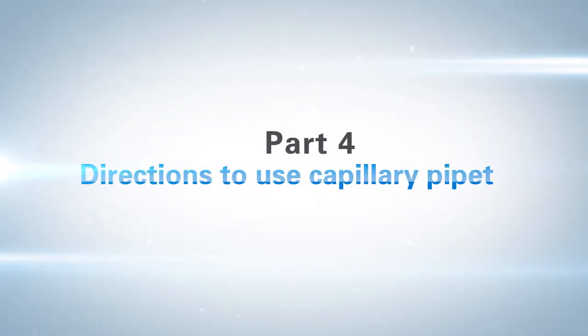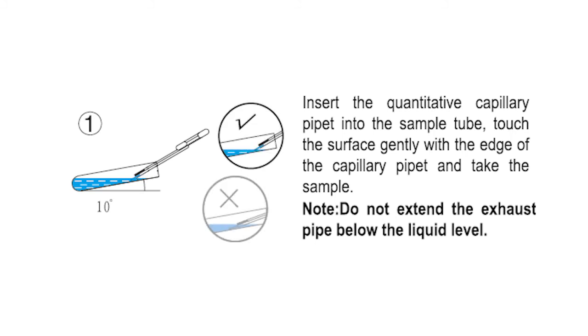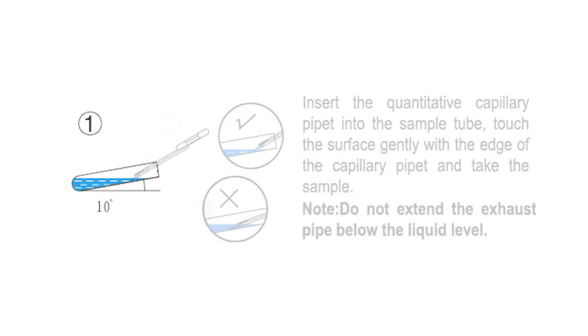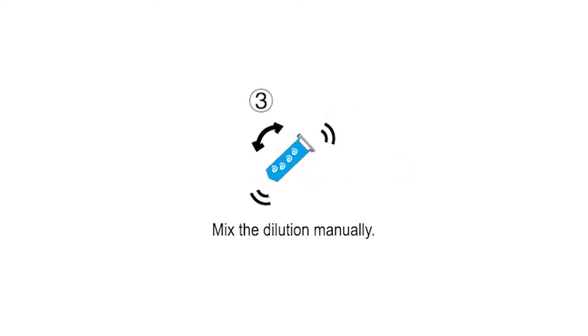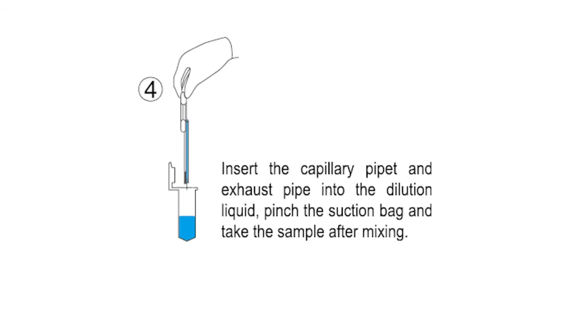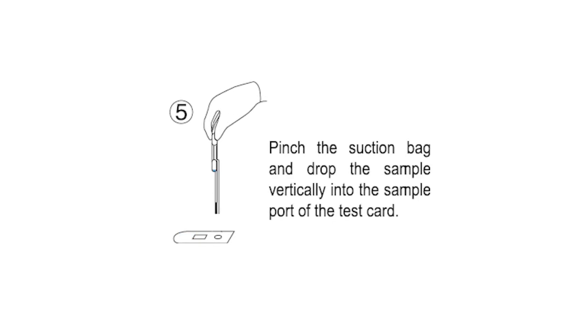Part 4: Directions to use the capillary pipette. Insert the quantitative capillary pipette into the sample tube and touch the surface gently with the edge of the capillary pipette to take the sample. Do not extend the exhaust pipe below the liquid level. Insert the capillary pipette and exhaust pipe into the dilution liquid and pinch the suction bag gently to clean the capillary pipette two to three times. Mix the dilution manually, then insert the capillary pipette and exhaust pipe back into the dilution liquid, pinch the suction bag, and take the sample after mixing. Pinch the suction bag and drop the sample vertically into the sample port of the test card.